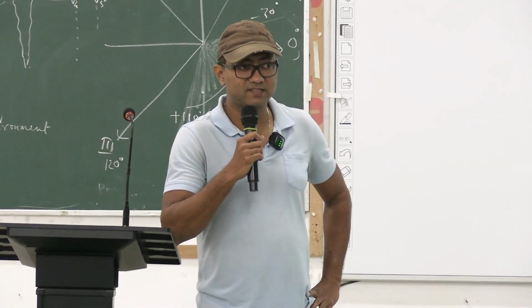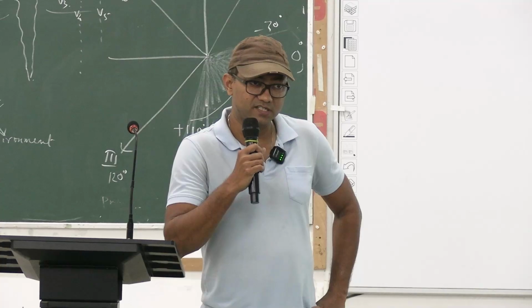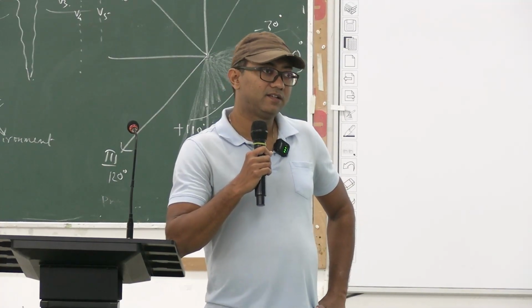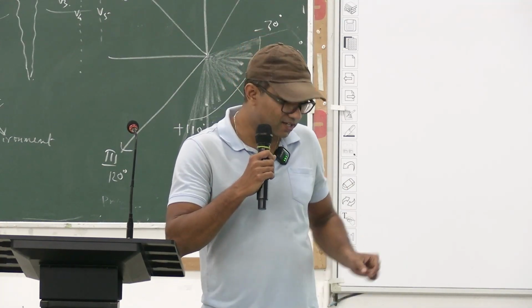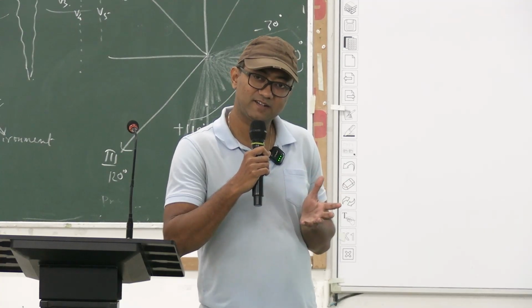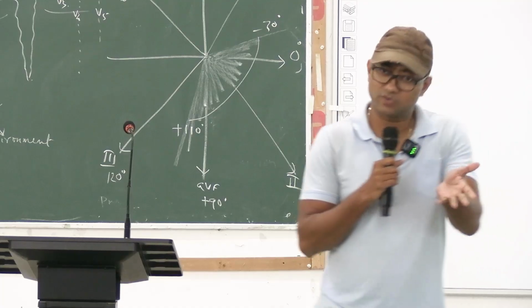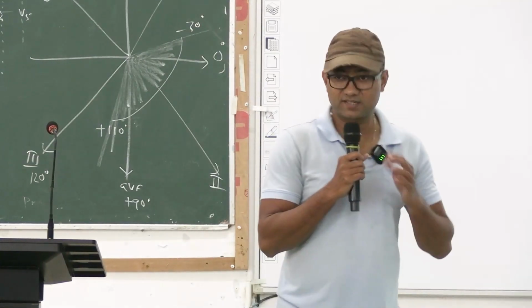But will you do that once a patient comes with his or her ECG, and you are taking out a pencil, an eraser, a protractor, a scale, and drawing something for calculating ECG axis, and the patient is waiting? Will you do that?